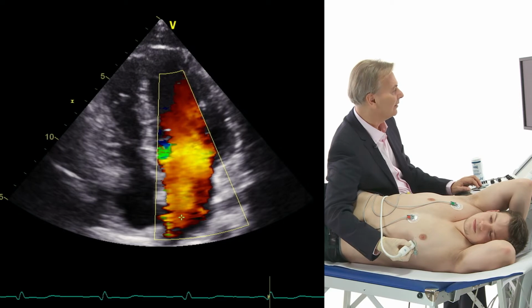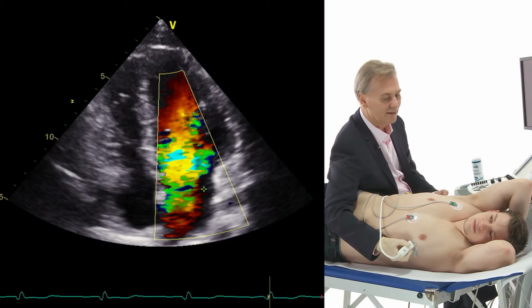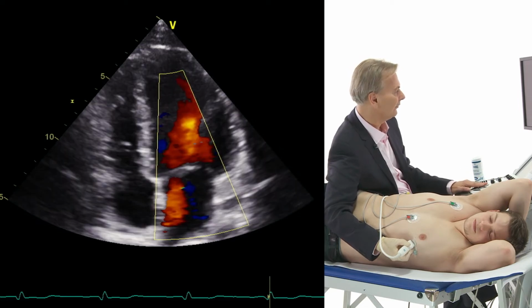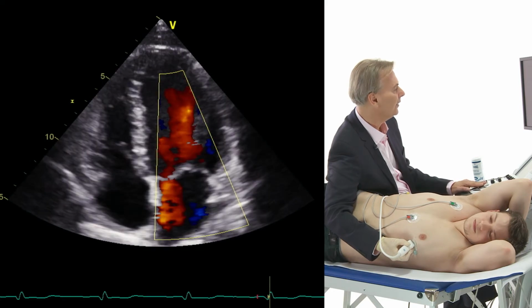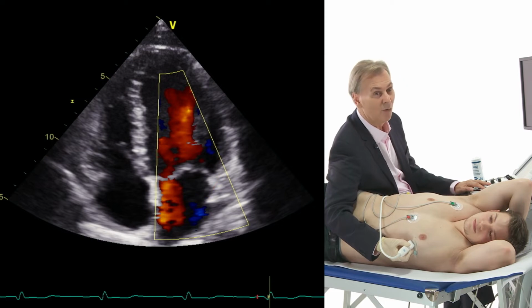Here is a frame during the filling phase during diastole. We see red, in other words, flow from the left atrium into the left ventricle. This is normal flow. If we just go back a bit, we see that there's even a frame where the velocity is so high that you have this mosaic color. The reason is simple. He's a young individual and he has a very high cardiac output. If we go to a systolic frame, we see that there is no backflow. Let me find one here. Here, there is no backflow of blood from the left ventricle into the left atrium during systole. In other words, there is no mitral regurgitation.